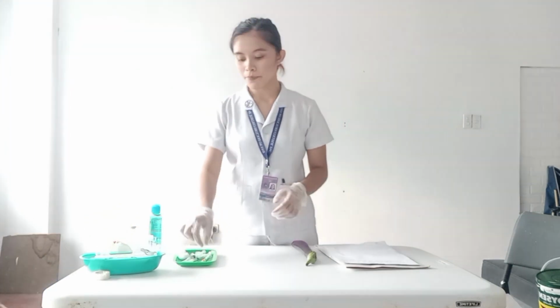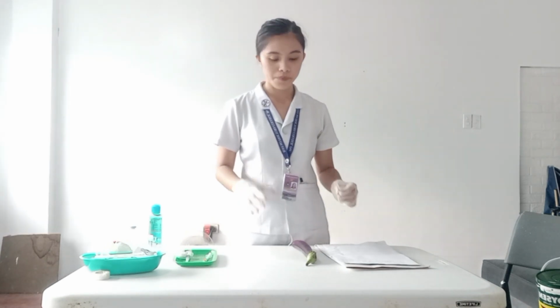While waiting for the antiseptic to dry, remove the needle cap and expel any air bubbles from the syringe. The small bubbles that adhere to the plunger are of no consequence. Now grasp the syringe in your dominant hand, close to the hub, holding it between thumb and forefinger. Hold the needle almost parallel to the skin surface, with the bevel of the needle up.